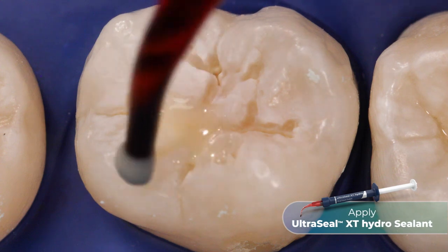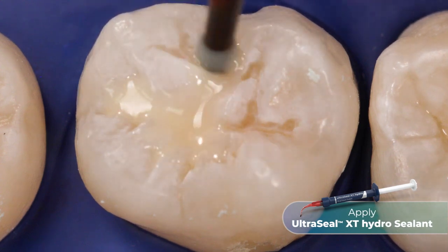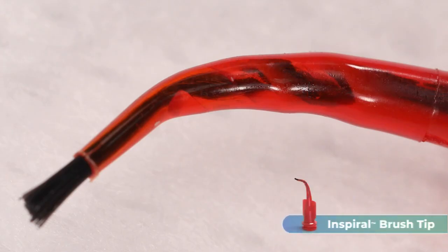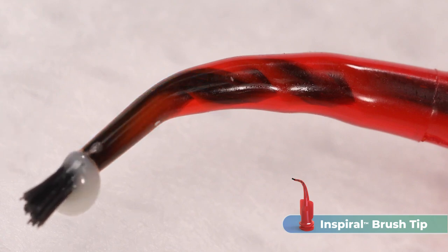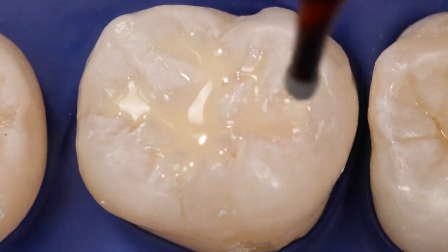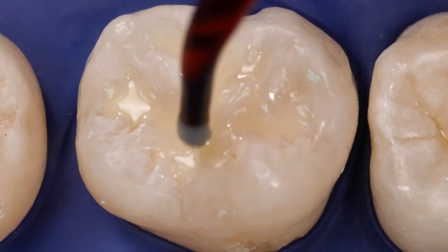Express a small drop of UltraSeal XT Hydro Sealant into the grooves. Work the resin down into the grooves with the brush tip. The spiral brush action of the Inspiral brush tip causes shear thinning of the thixotropic UltraSeal XT Hydro Sealant. The resin stops flowing when the shear thinning ceases and placement is complete, preventing it from running before it can be light cured.